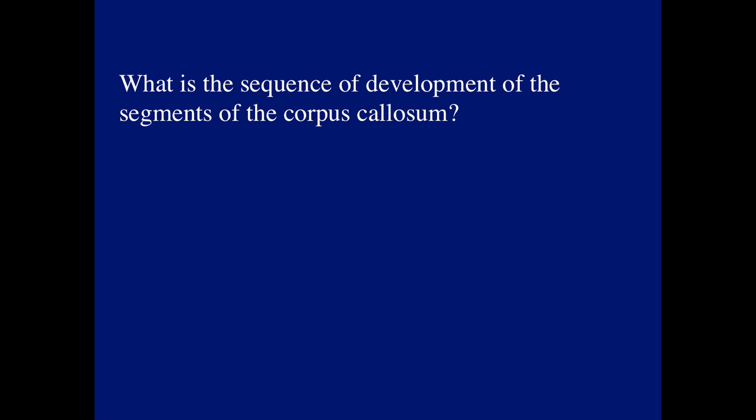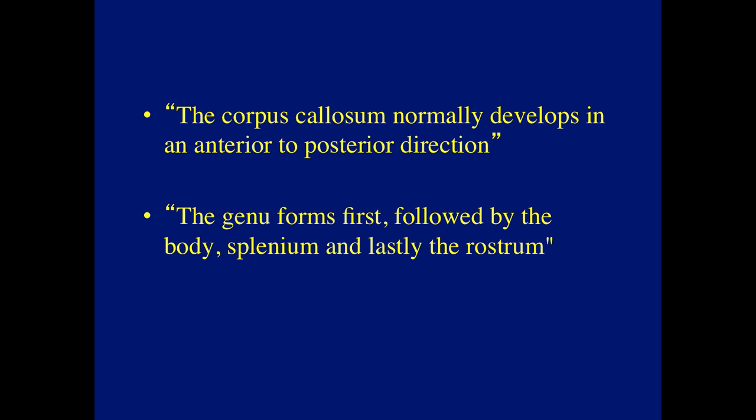What is the sequence of development of the segments of the corpus callosum? As people said, this is what has been written up many times.